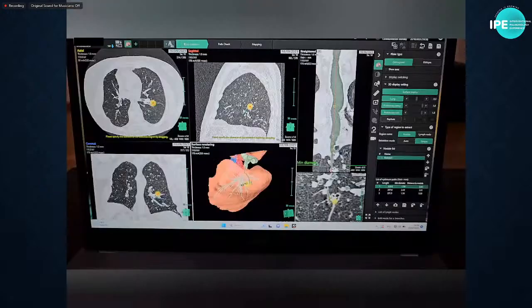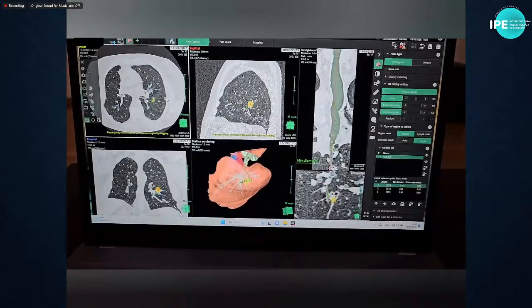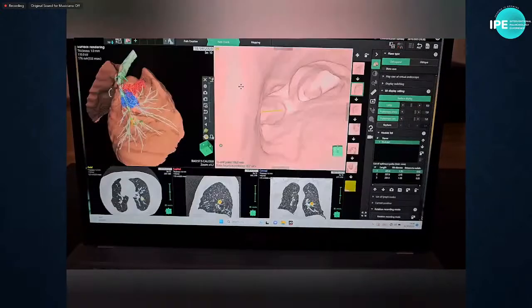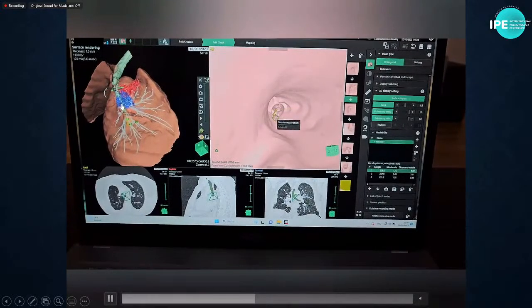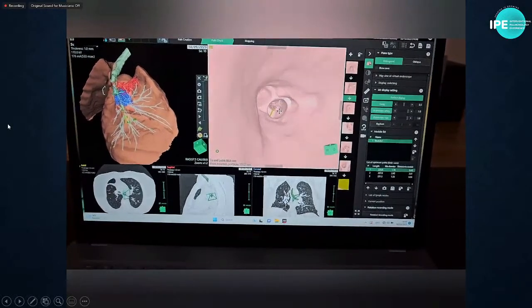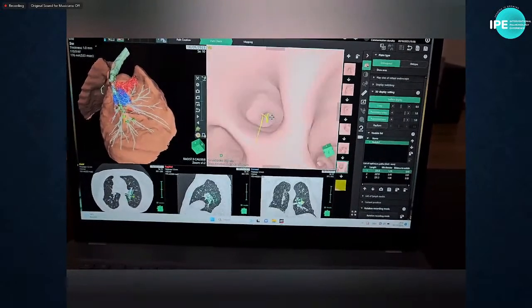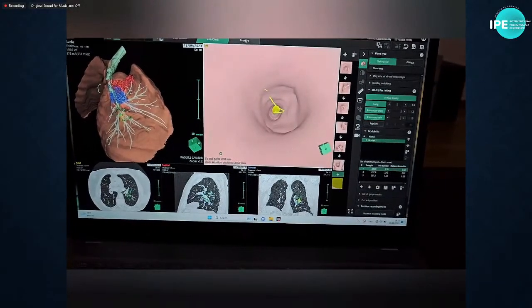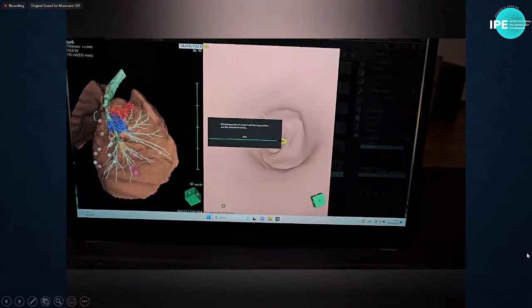So here's an example of a virtual bronchoscopy from the company Fuji. The yellow part on the screen is the tumor that I was going to biopsy that day. You can see little highlights of the vessels in blue. So you have a map here of the airways while you're looking at the biopsy zone, and you can see the blood vessels that are near the zone so that you can say this is a viable zone or this is not a viable zone.